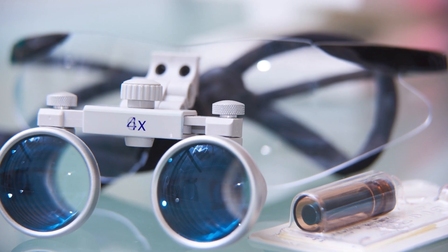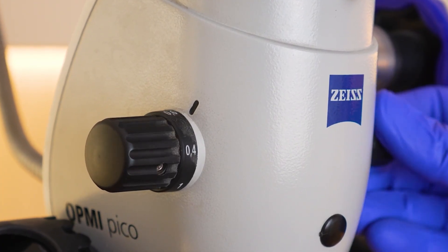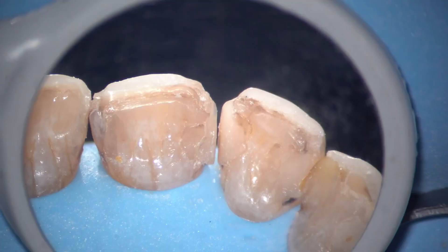Let's start with the most obvious one: magnification. Loops and microscopes are both used because they help us magnify what we are looking at. However, they're very different. With a loop, you need to decide in advance what kind of magnification you need — 2.5x, 4x, 6x, and so on. With a microscope, it isn't like that. Microscopes offer a wide range of magnification starting from as low as 2.5x and can go as high as 30x or more. You have the flexibility of switching between magnifications, whereas with a loop, 9 times out of 10, you need to buy multiple loops. The microscope wins here.